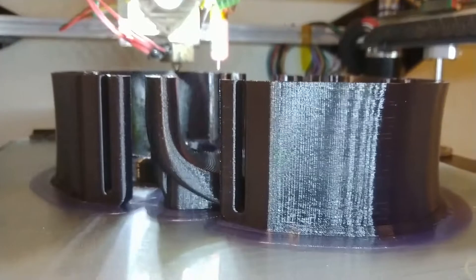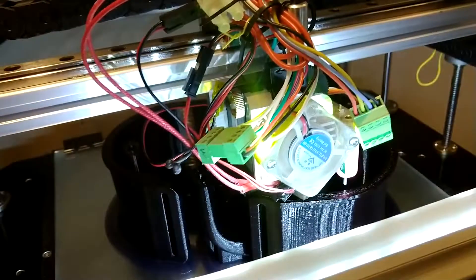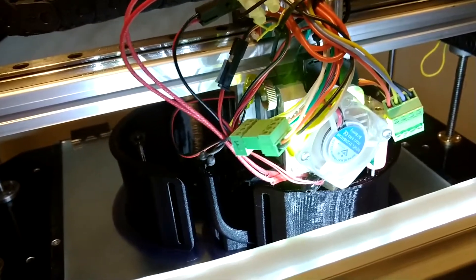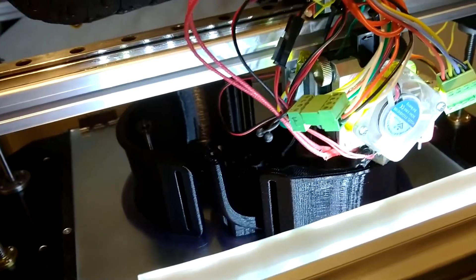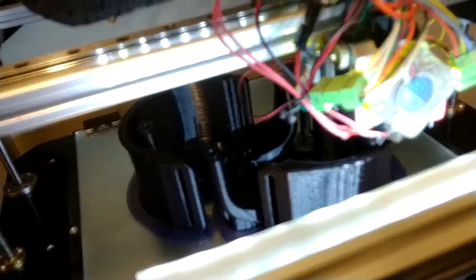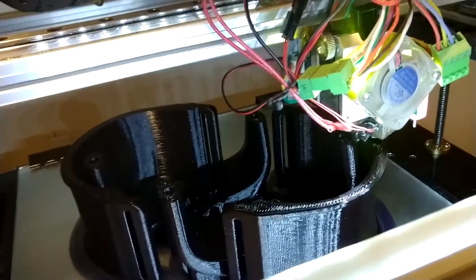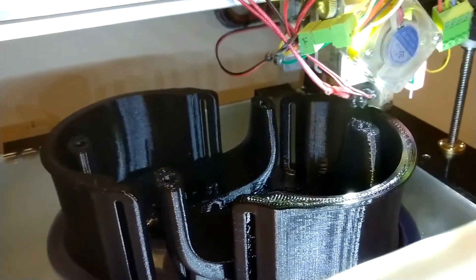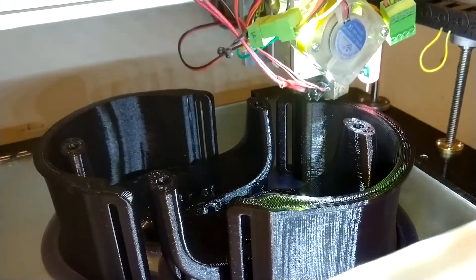The printer can churn out roughly one set of these ankle-foot orthotics per 24-hour period. The final product still needs to be broken apart, deburred and trimmed, and then assembled with additional components such as titanium flex rods, webbing, padding, and things like that.